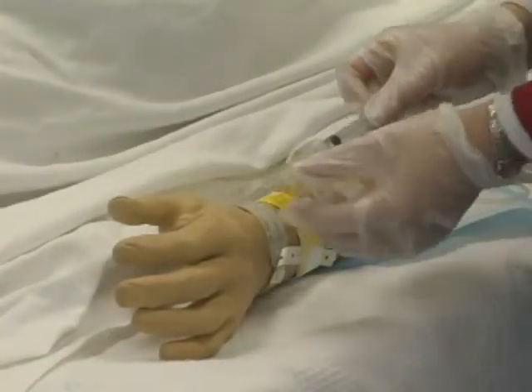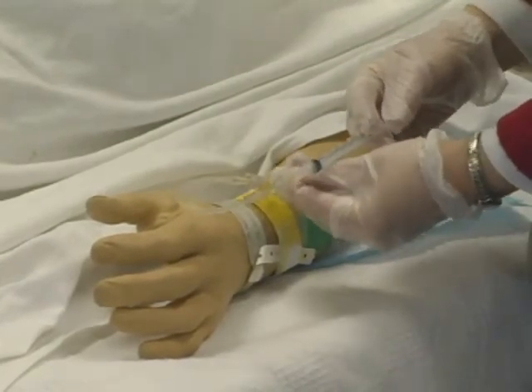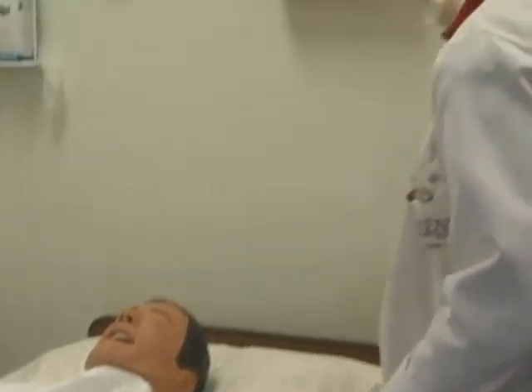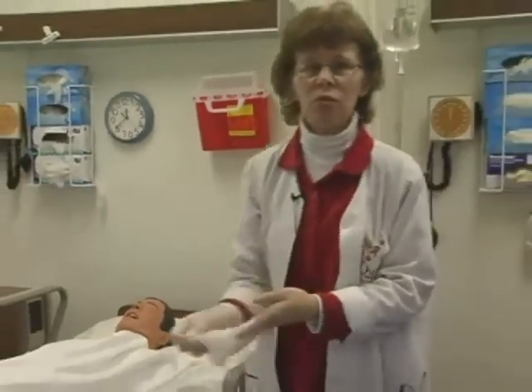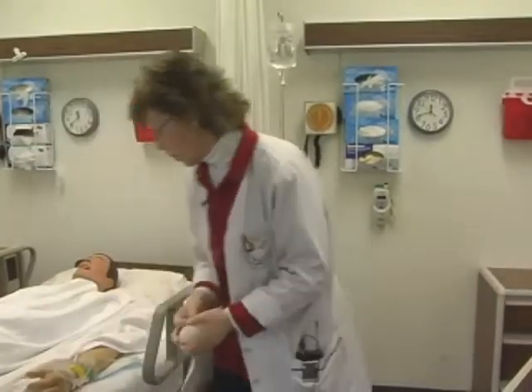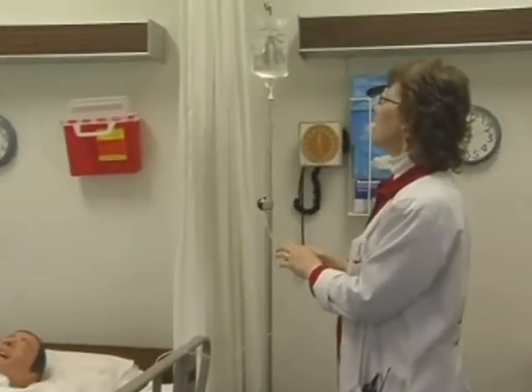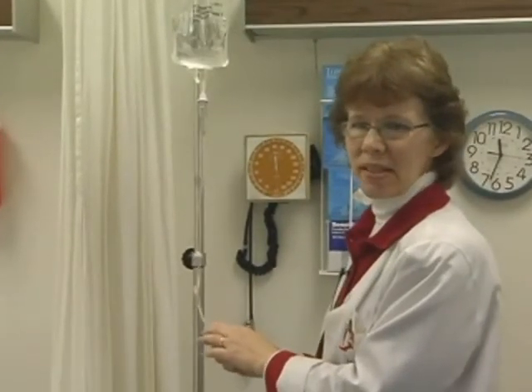So the 30 seconds are done. I'm going to clamp, push, release, and the medication is done. So I can withdraw my needle. And I'm going to throw it in the sharps container. And I'm able to remove my gloves and throw my supplies away. I will readjust my rate to what it was previously.